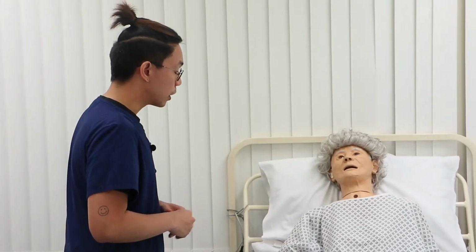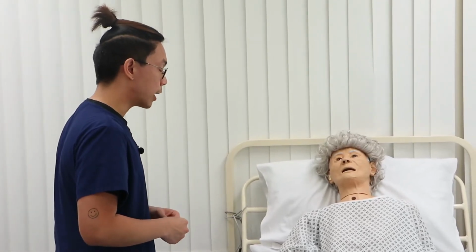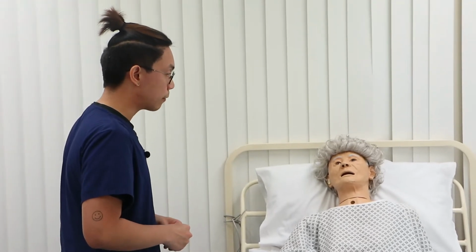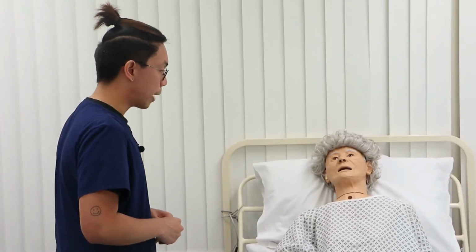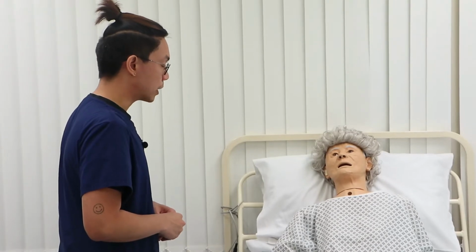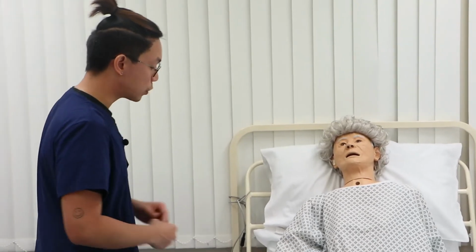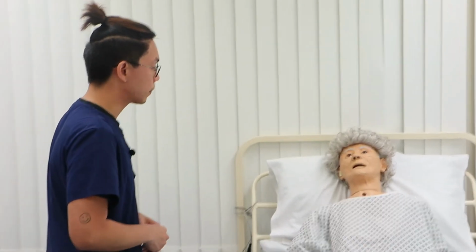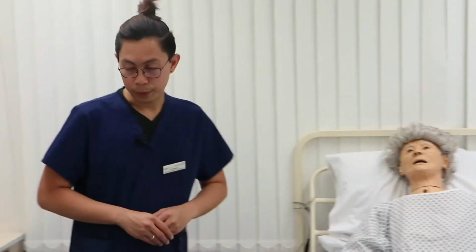Yeah, that's clear. Do you want me to repeat the instructions? No, that's fine. Lovely. So, is this a convenient time for us to do it? Yes, it is. And are you happy for me to do it? Yes. Okay, so if that's the case, I'll just prepare my materials. I'm leaving you this call bell. If you need me, just press it. So I will be here to assist you, okay? Yes, thank you. Right, so now I'm going to prepare my materials.